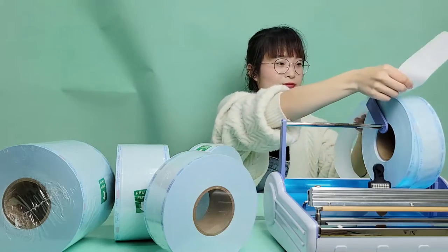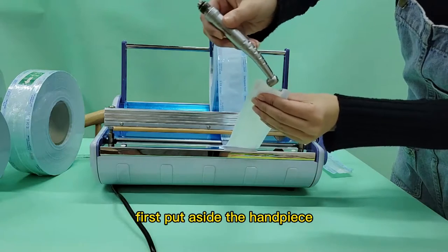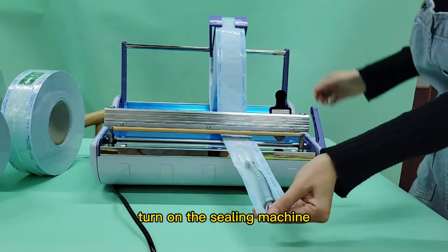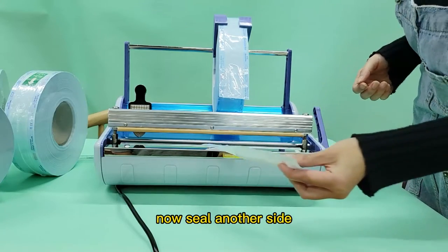Now let us see how it works. We test our handpiece with 5.5 centimeter pouches. First, put aside the handpiece. Turn on the sealing machine. Now seal another side.